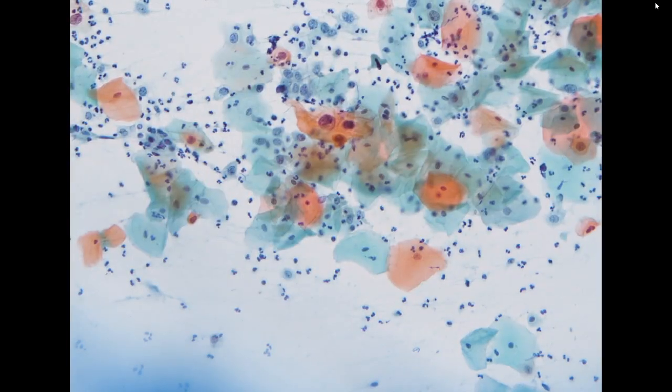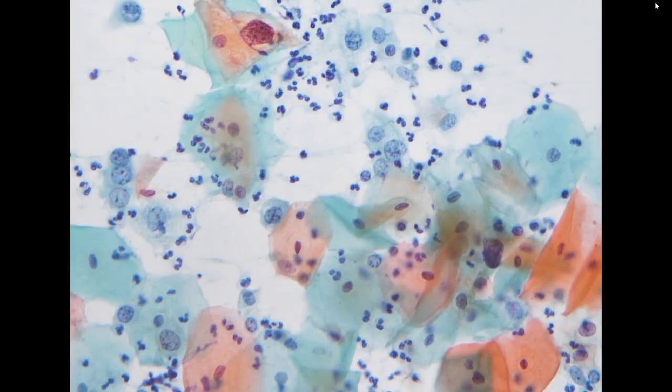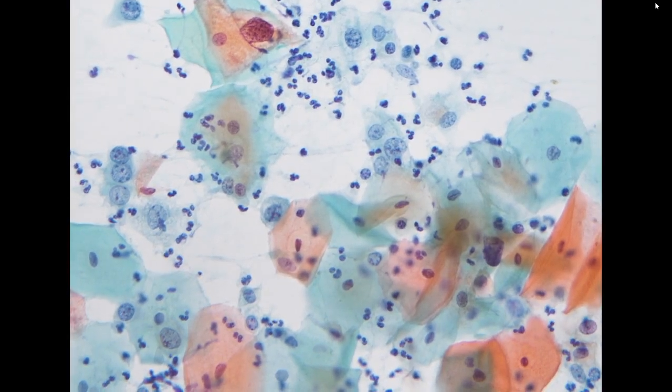In a patient with a big intraepithelial lesion like this, because along the smear direction we see a lot of clusters of cells that look like HSIL, it is not uncommon in the excision biopsy specimen to see microinvasion.